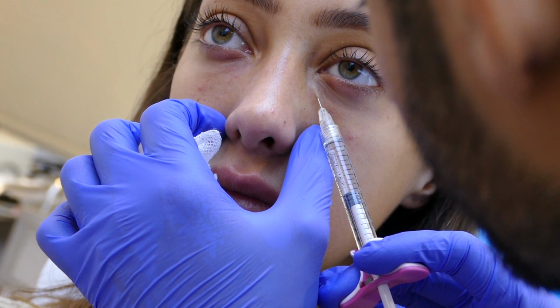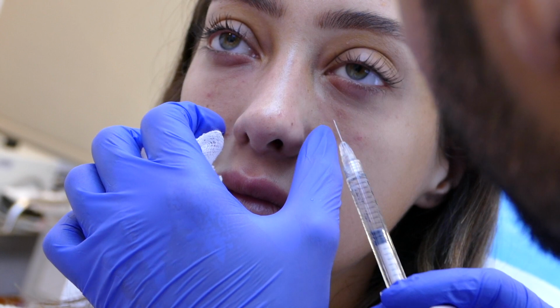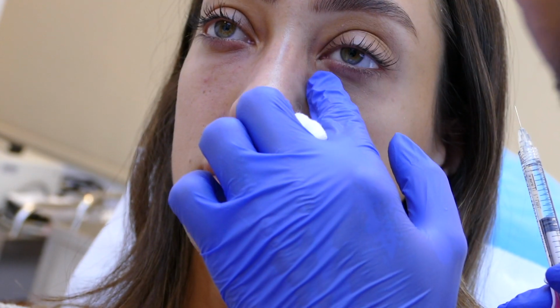Be aware that the vein travels just very close to this part of the tear trough. Remember, the vessel is located above the orbicularis muscle. In such patients, usually 0.5 to 0.6 ml is enough on both the sides, and I prefer to wait for about a couple of weeks before injecting any further.